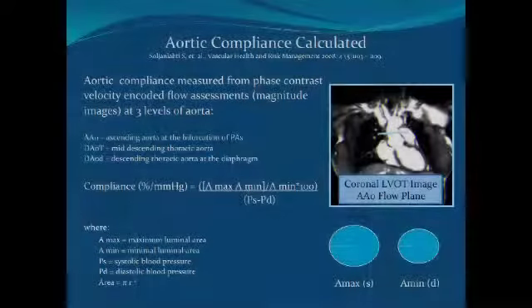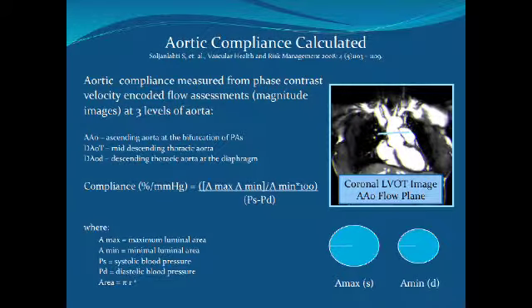John used, and I'm a clinician, so any questions about SimVascular software, you have to ask John. He used the SimVascular software package to, again, make these little tetrahedron models, so to kind of segment this so that you could apply your mathematical equations in an area where flow was relatively constant. He used the three-element Windkessel representation on the flow data that we had provided for him, and then used resistances as noted in this table to apply that.